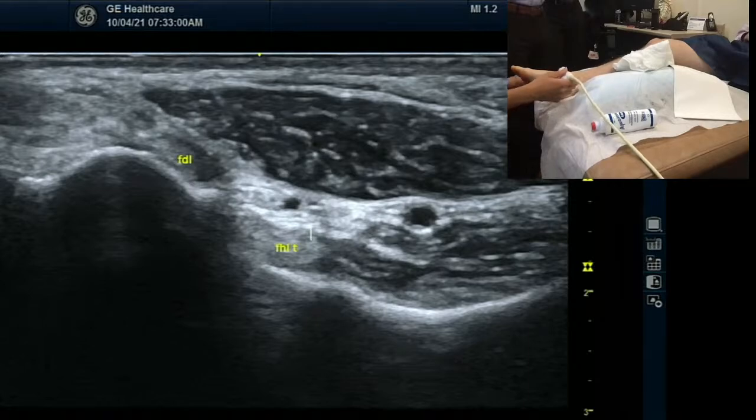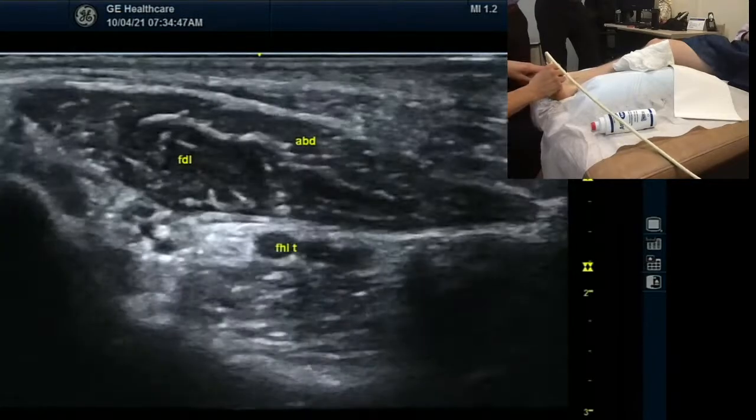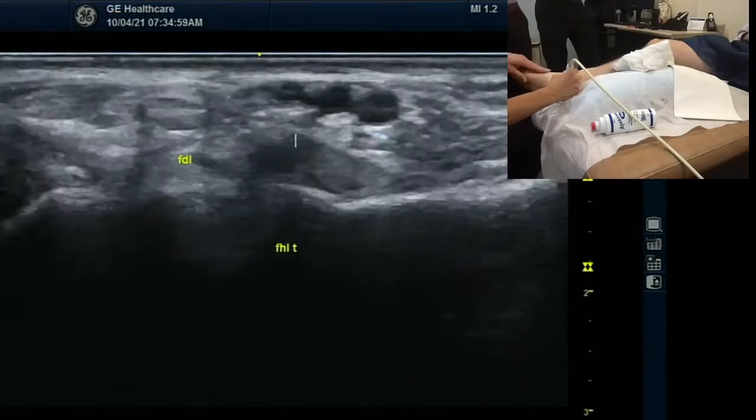So this must be a medial plantar over here because it's abductor hallucis. And this is the flexor hallucis longus. It must be with the artery — this must be artery. Is that the abductor hallucis? AB. I wouldn't label that yet. But I will label — only if you're absolutely sure. It's a working hypothesis. Then where are we now? That is definitely an artery. Let me go back up there. So home base, right? So FDL, FHL. I'm going to come scan down.